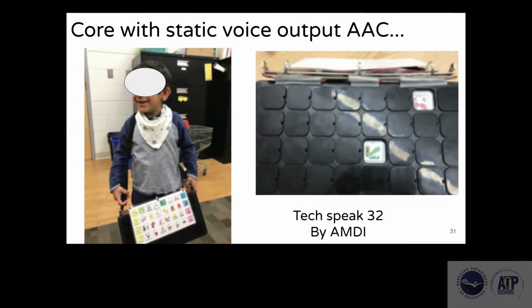And sometimes when we're targeting certain words, or if we want to show the student the power of using their device, we may start out with just a couple words. Again, we open it up as soon as we possibly can, and that's always the goal. But to start off, some students just need to have a couple words available, and to understand the power of using their words and communicating.